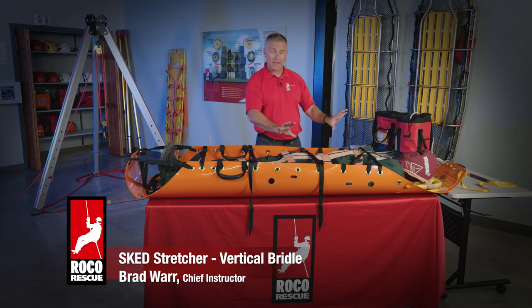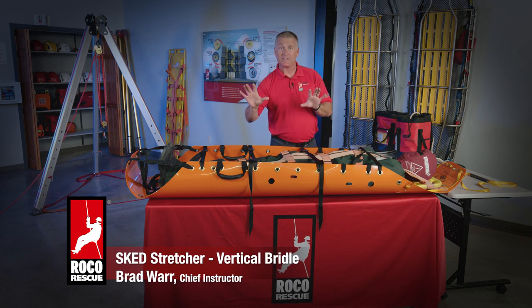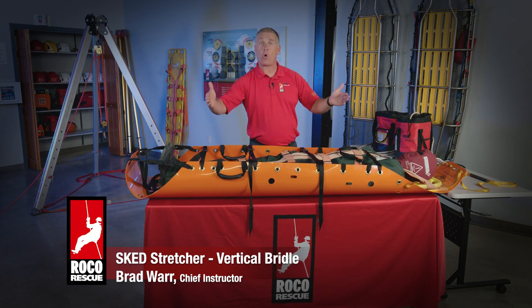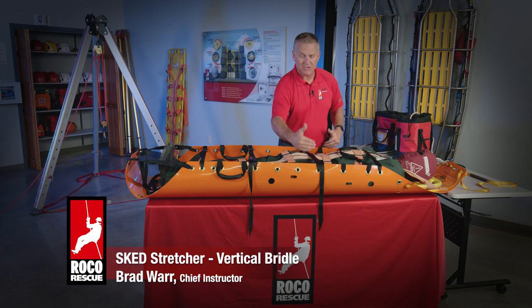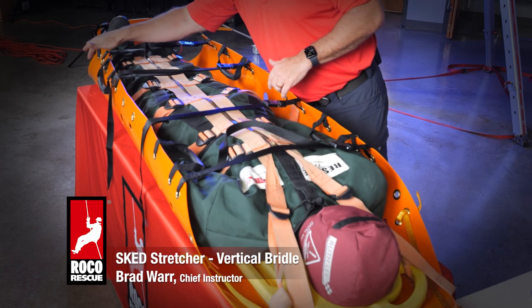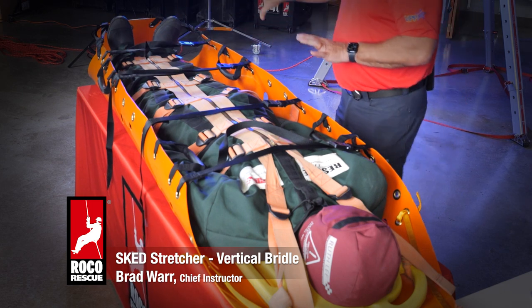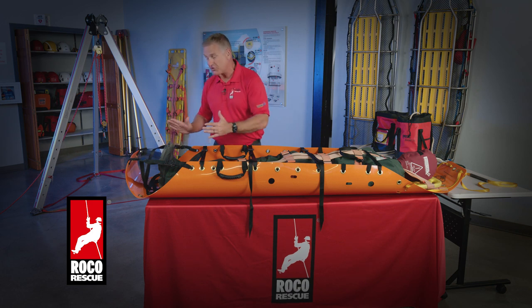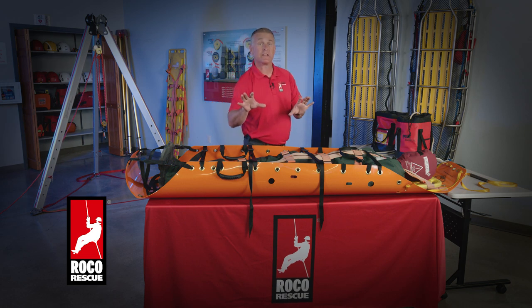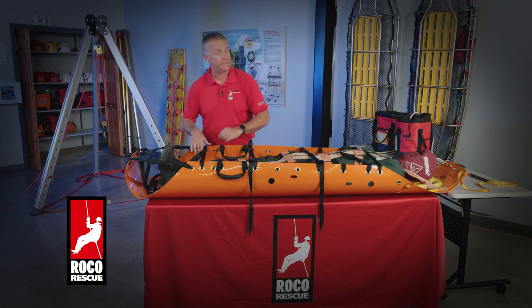I've got my sked up here on the table, with Rescue Randy already placed in it. I've taken the four cobra buckle straps that go horizontally across and tightened them up just to keep the sides upright. That allows me easy access to these grommets and handles as I work my way down the sked. I've tied up the feet strap — his feet are to the inside. I can go inside or outside depending on what I'm going through in a confined space, but generally we start with his feet to the inside and the straps to the outside of the feet.